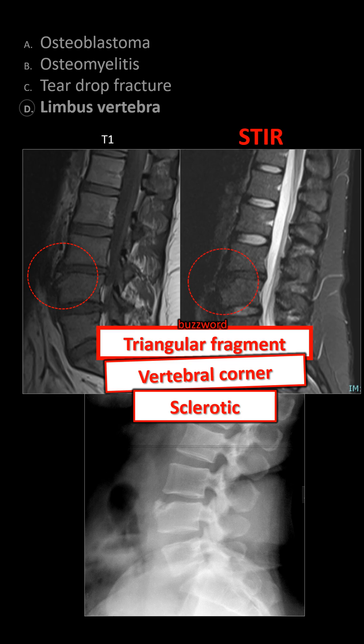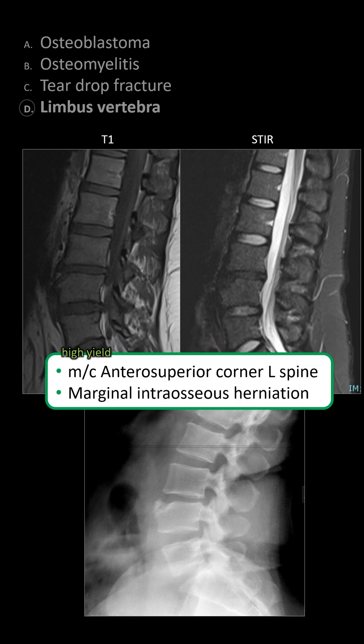In this case, no edema on STIR, so it's not an acute fracture or infection. The most common location is at the anterior superior corner of the vertebral body, most often in the lumbar spine. This is due to marginal intraosseous disc herniation, like a Schmorl's node.